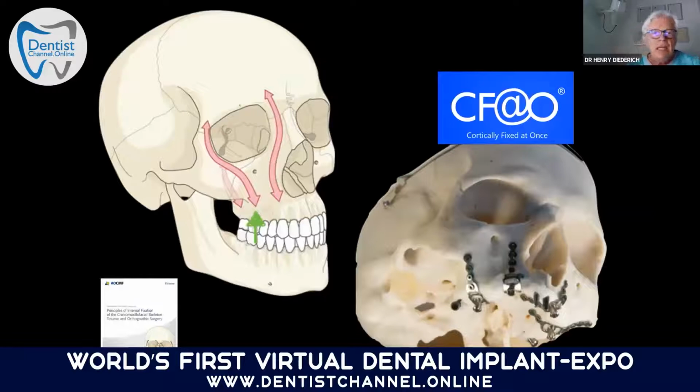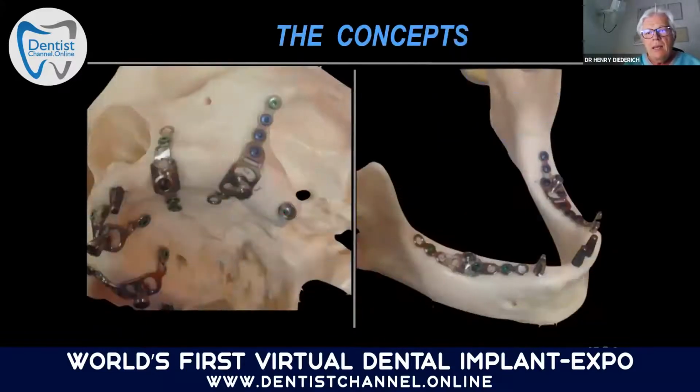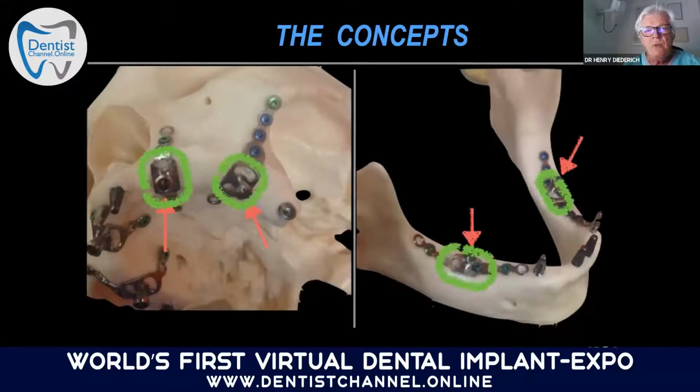You see, we are looking for a vertical pillar in the face on your left side. And here you see our plates, which are used to fix on this part of the bone, because that is a strong cortical bone. You see here, we fix the plates. The plates are adapted to the bone, and they are screwed with osteosynthesis screws.